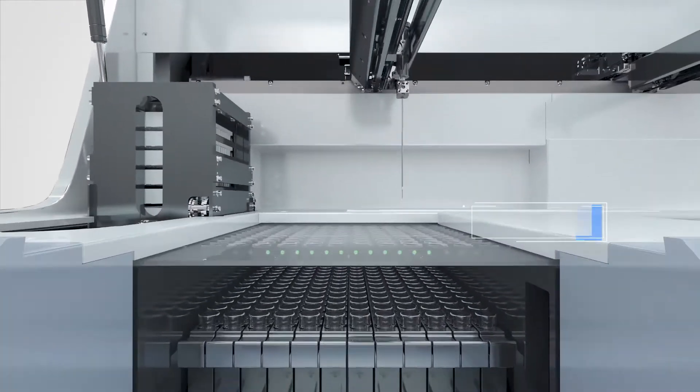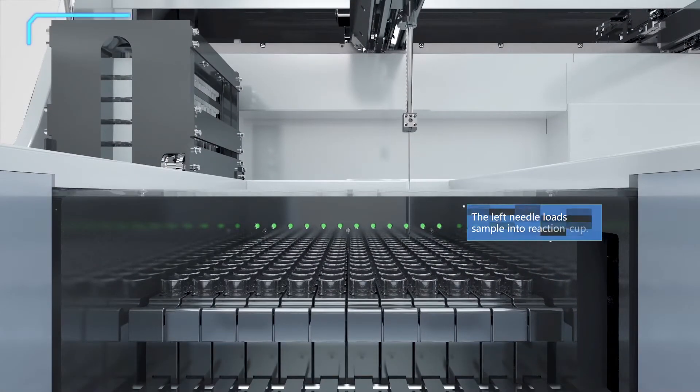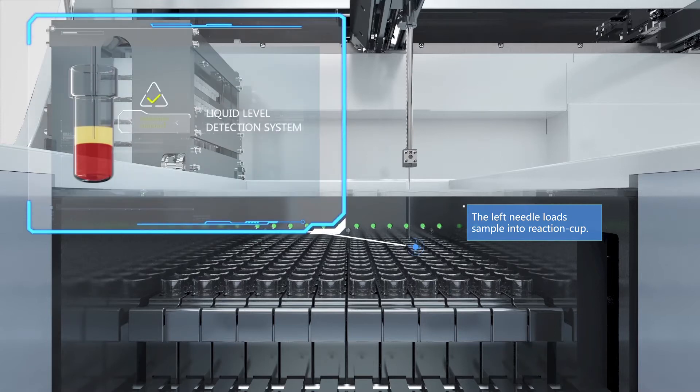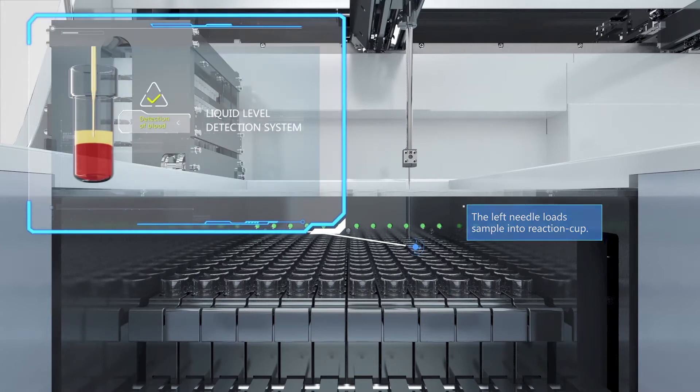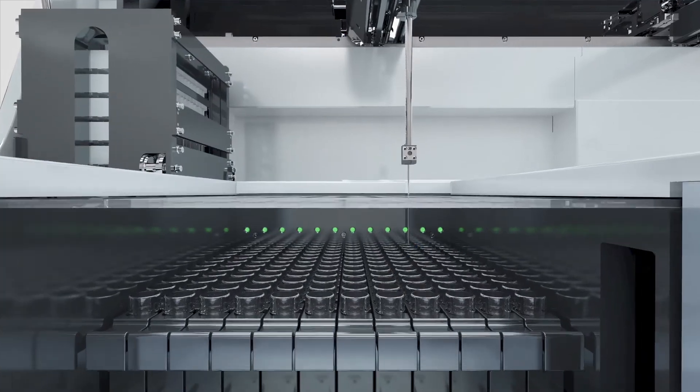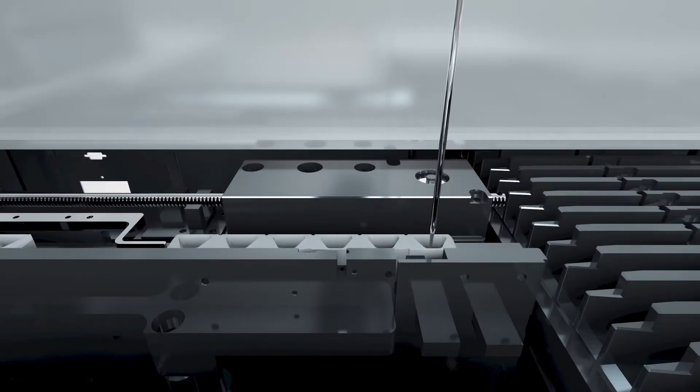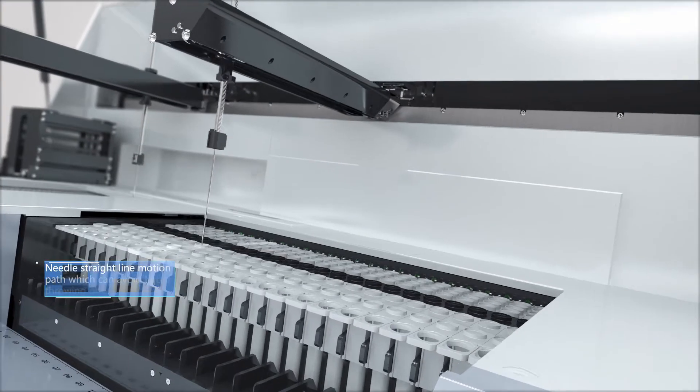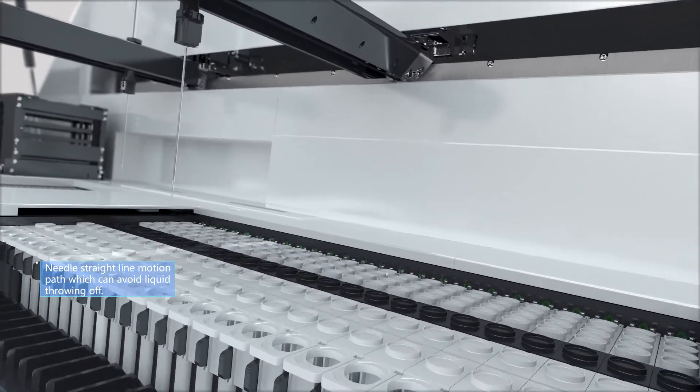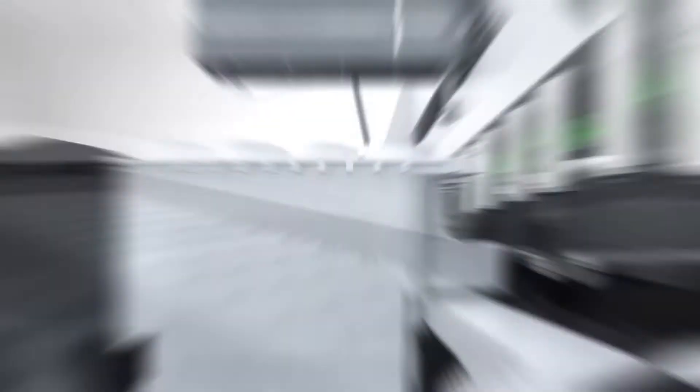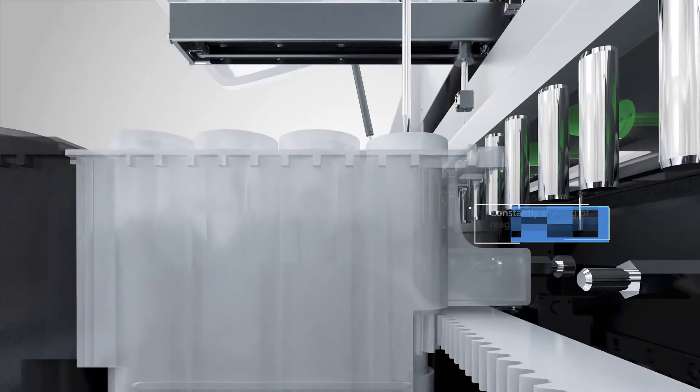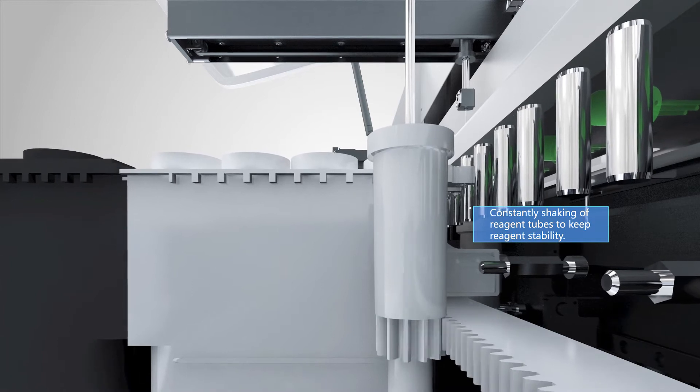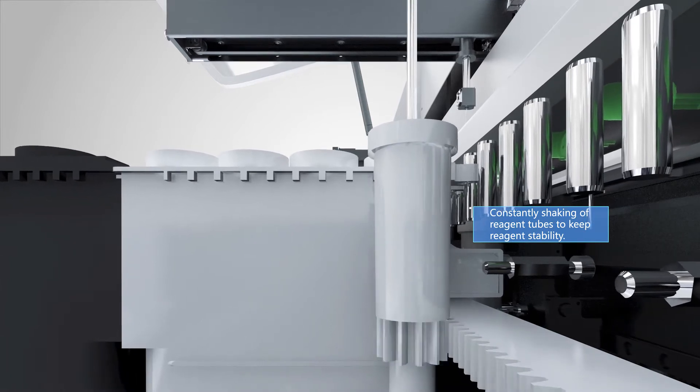The testing process standardization is achieved by fully automatic test and advanced quality control system. Accurate sampling can effectively control the testing variations. Neat straight line motion path which can avoid liquid throwing off. Constantly shaking of reagent tubes to keep reagent stability.